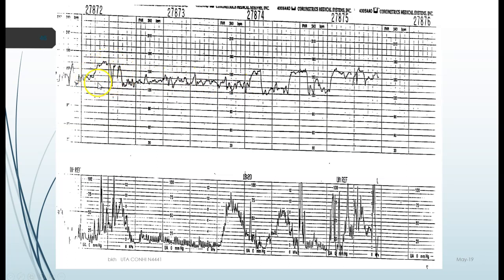And then we have these big increases, this big acceleration. This accelerated up to the 160, and this lasted about a minute. We've got good variability. We've got good fuzzies on our baseline. They're not greater than about 25 beats per minute. So that's moderate variability, well oxygenated.